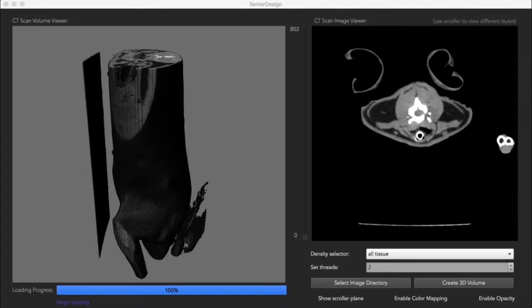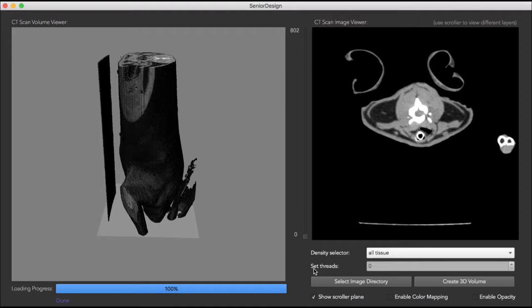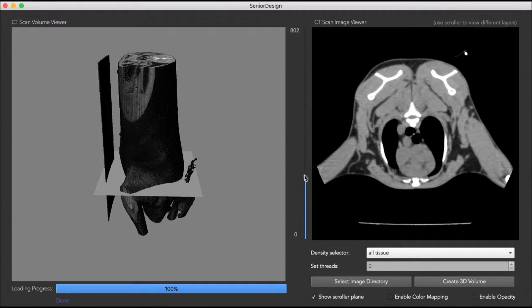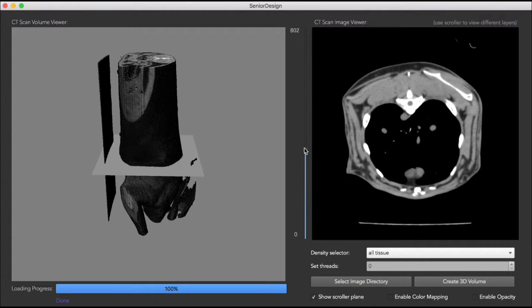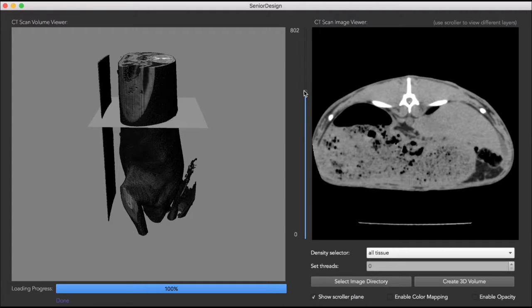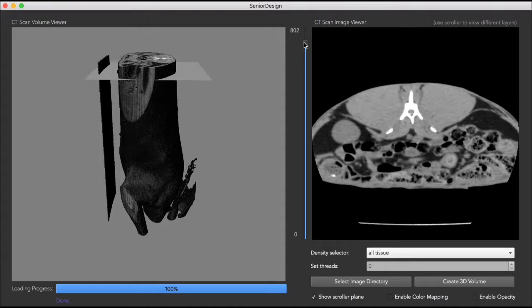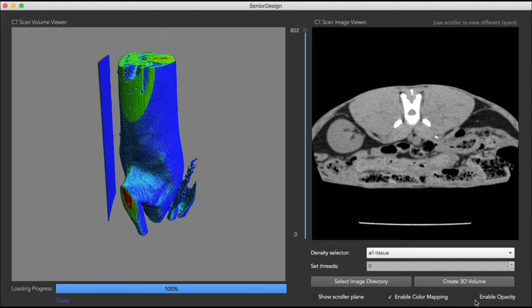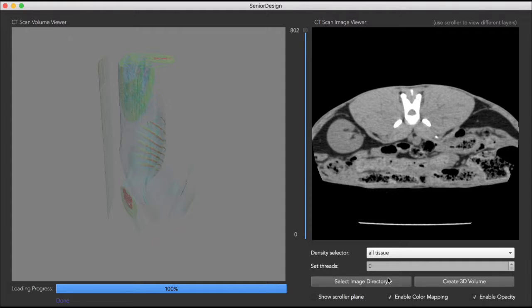There are also the options to enable color mapping, to show a scroller plane, which, as you scroll it up the rabbit, will show the corresponding CT scan that created that layer. So these are the 2D images that correspond to this point, that plane in 3D space. There's also the option to enable opacity, and this can give you a little bit of a glimpse into what the inside of the rabbit looks like.